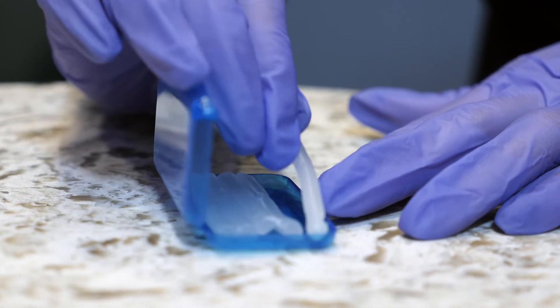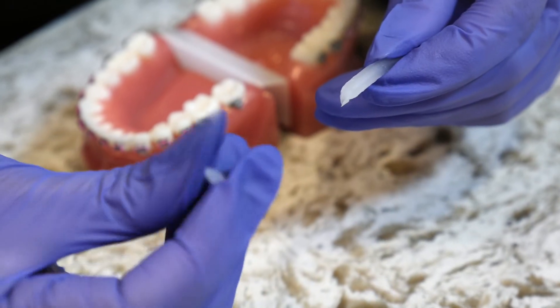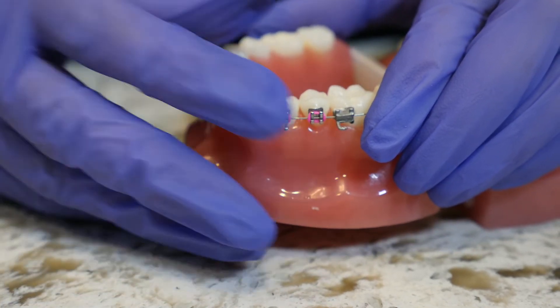You will get some dental wax that we gave you at your first appointment. Roll it in a ball and stick it on that bracket that is broken so it doesn't slide around.